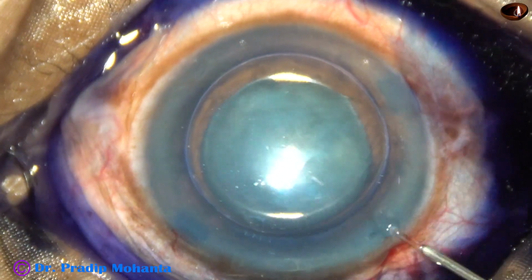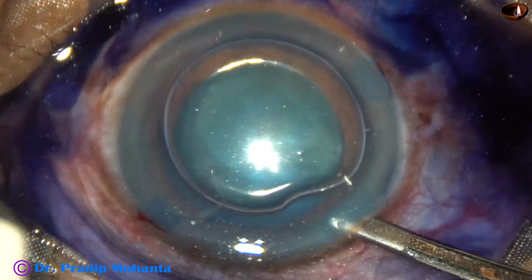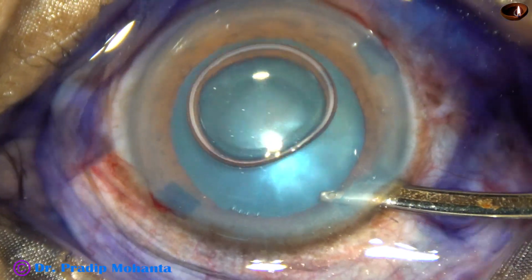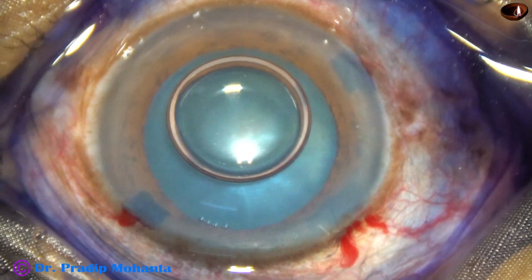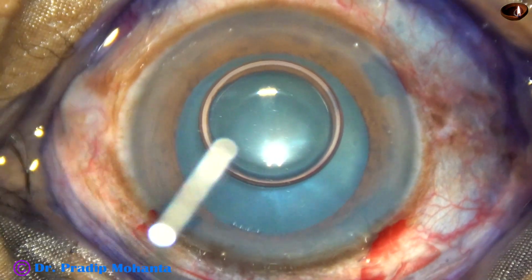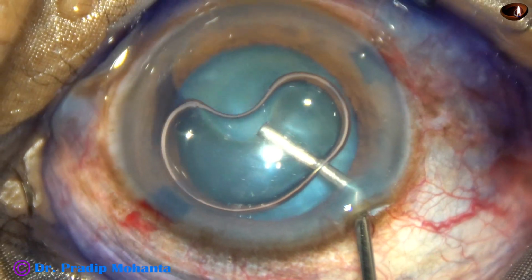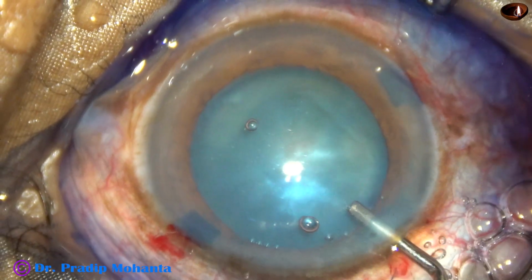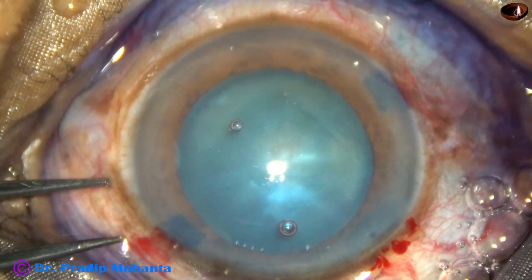This is a bit of adrenaline to see if the pupil dilates a little more, and in this case it did dilate a little more. So this is washing out of the dye, and now 2% hydroxypropyl methyl cellulose is injected into the anterior chamber. The BSS and air bubble are replaced by the visco, and now capsular access is to be done.